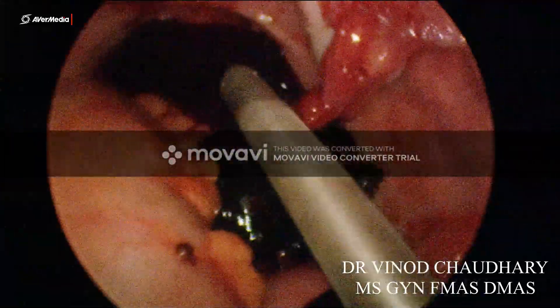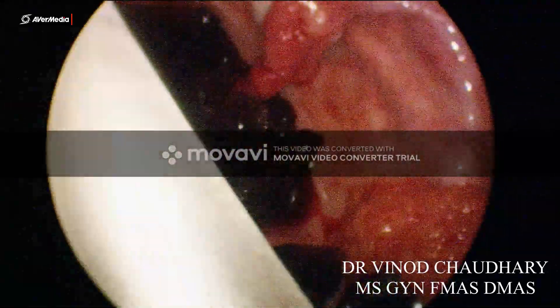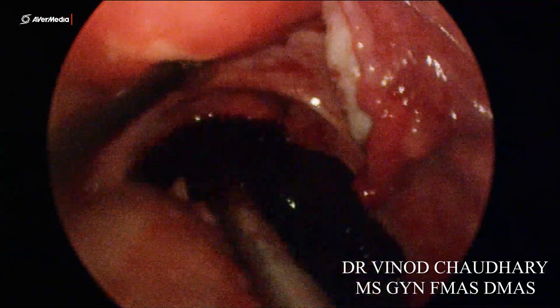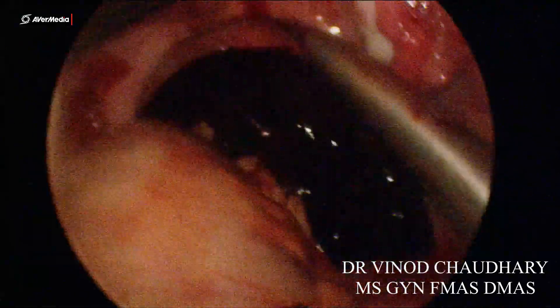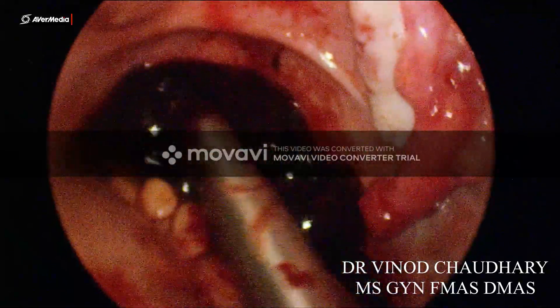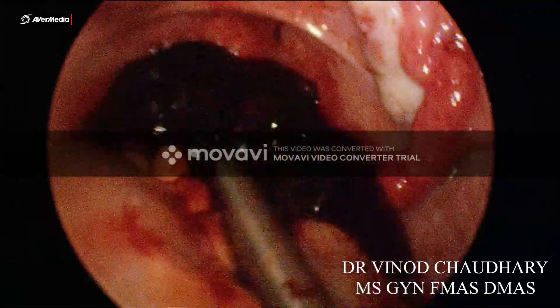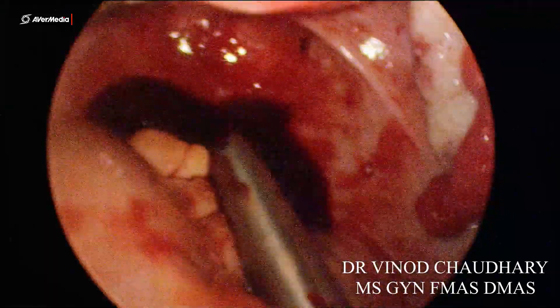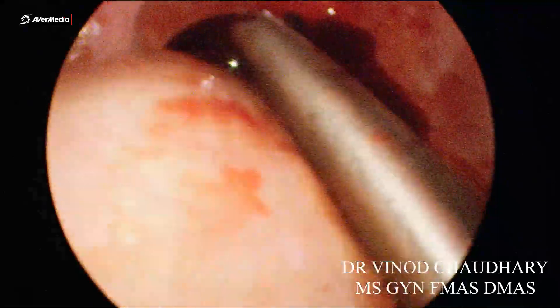Now this is the 10 mm suction — it does the job very fast and very quickly. But you need to remain more cautious when using this compared to the 5 mm, because it can suck out the omentum and that will be a little difficult to handle. So be a little cautious while using 10 mm suction. It can take out clots as you can see, and it cleans the area very fast.